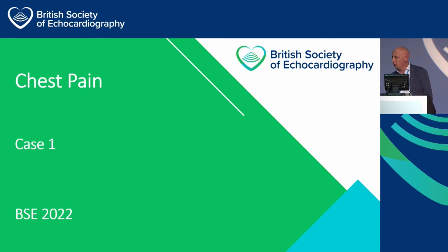And when we actually look at the new clinical triage guidance, chest pain is actually not an appropriate indication for an echo. It isn't in there. There needs to be more that's around it. So I'm going to show two cases. I'm going to keep it very simple and hopefully the images will move. You probably know what one of them is. You've probably never seen the other one, but we'll see.